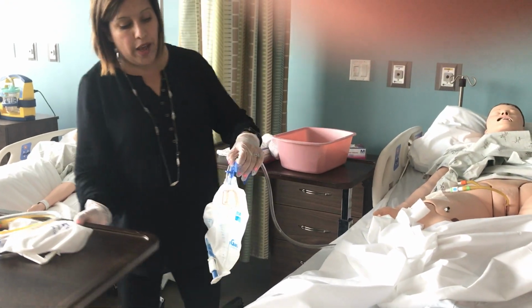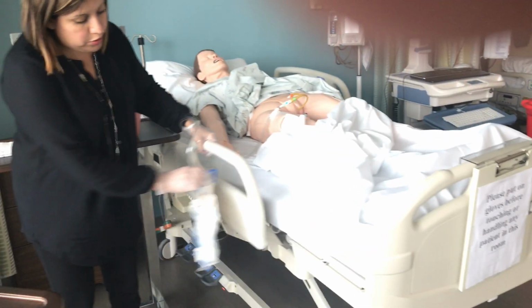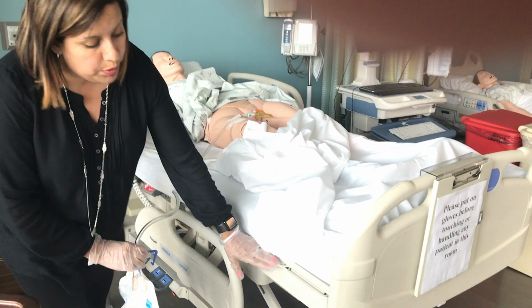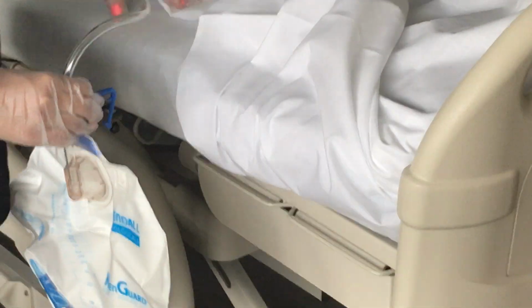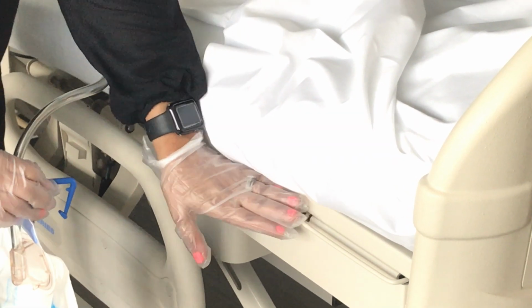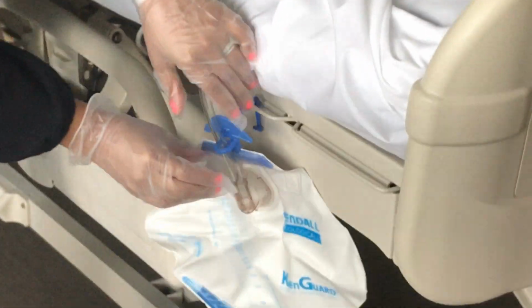When you hang this, it should never be on the rail. This is a no-no. Never on the rail. You should always put it on the bed frame. What's nice about these newer beds is that they have a location to hang your draining system, so you would just hang it right there.